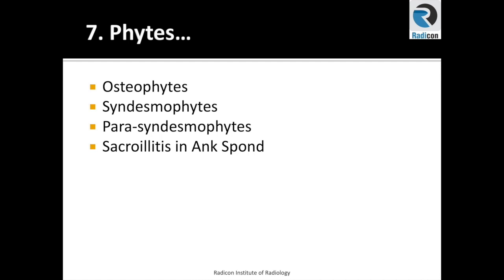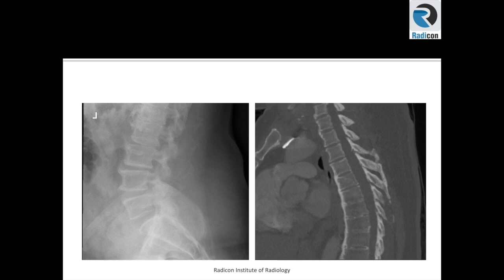Let's look at these two images. Both of these show abnormal corners of the vertebral bodies. There are bony overgrowths at the corners; however, these represent two distinct patterns of this abnormality.